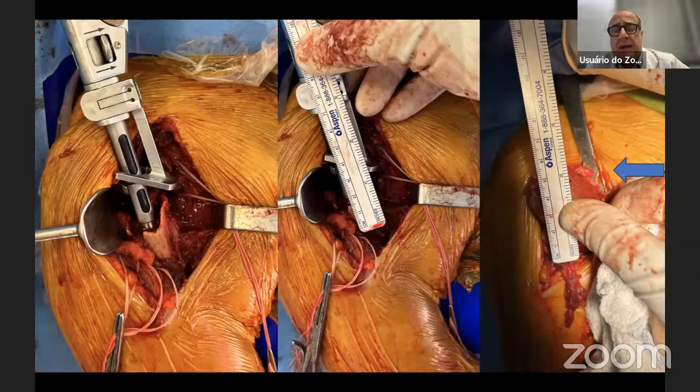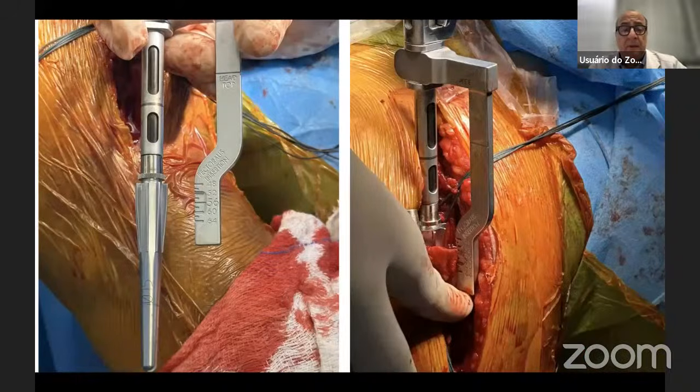So we have to be aware that if you are using different kinds of prostheses or different models, we can see that the measure can change or can have a height variability. Here, this is a device as a rule to make this measure. This kind of prosthesis is modular. We use a stem like the Wagner stem from the hip. This is a triple conicity stem.